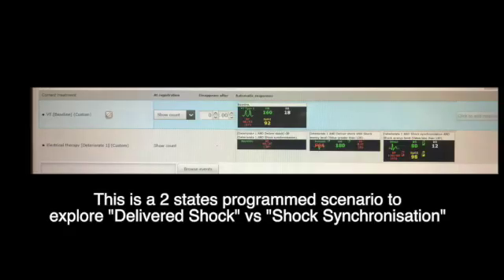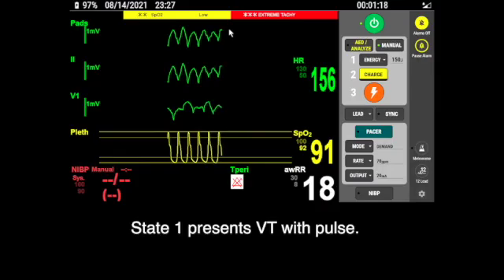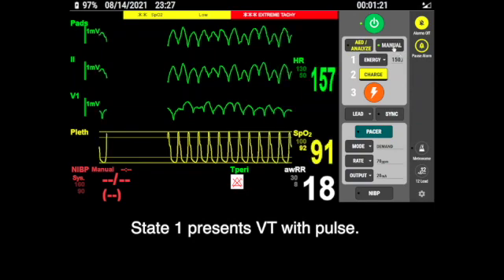Deliver shock versus shock synchronization in LLEAP. This is a two states programmed scenario to explore deliver shock versus shock synchronization. State one, present VT with pulse.